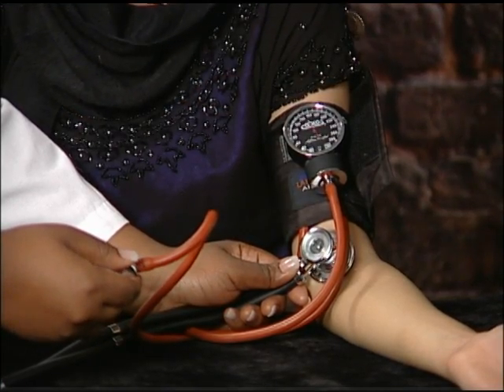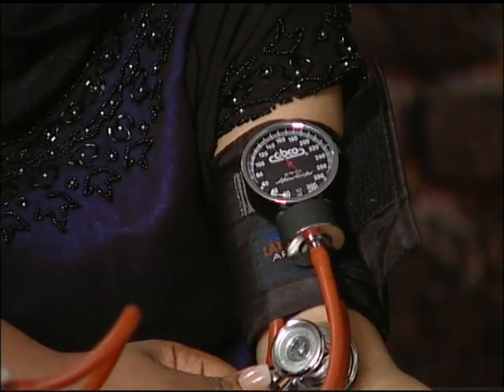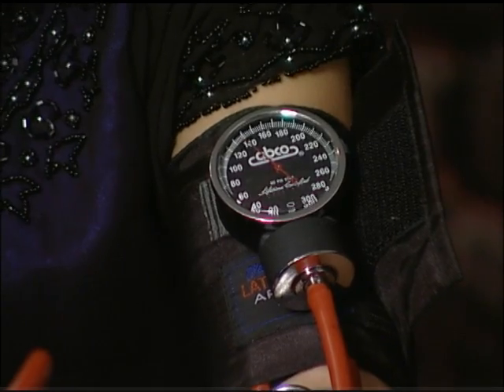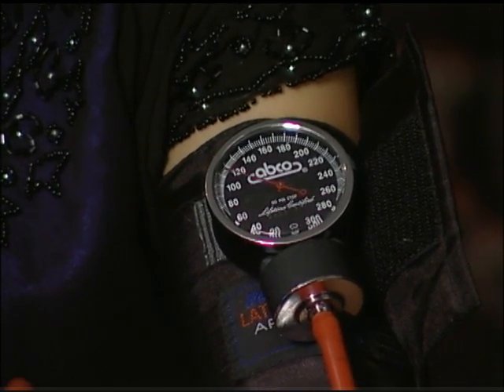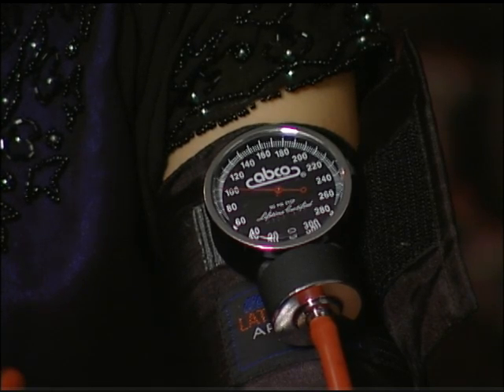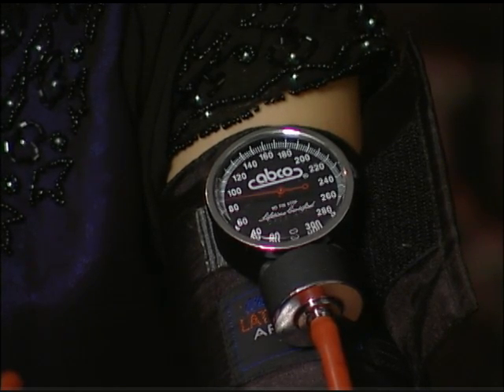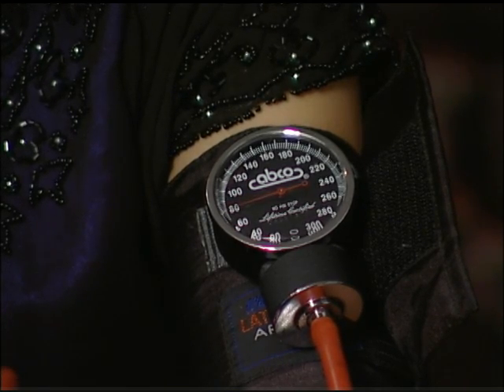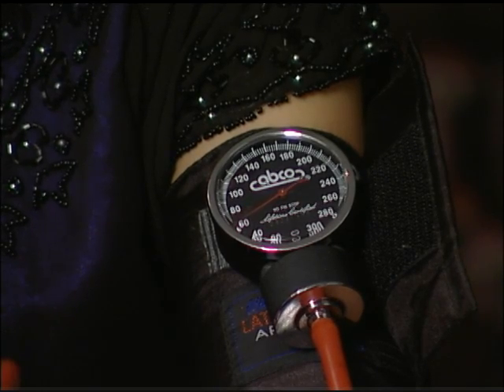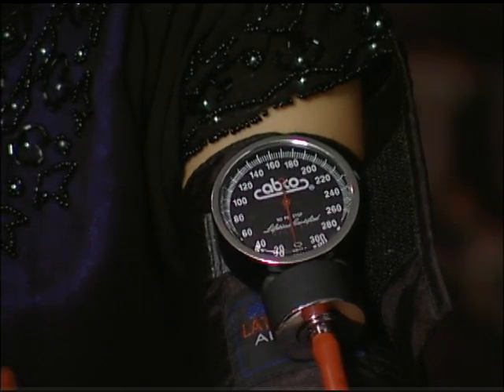Very slowly, deflate the cuff by opening the screw valve to reduce the pressure about 2 millimeters per second. As the pressure drops, you will hear beating sounds as the blood begins to pass through the vessel. Remember the number at which the pulsing sounds start — this is the systolic pressure. Continue to slowly lower the pressure until you can no longer hear the sounds in the stethoscope. The number at which the sounds stop is the diastolic pressure. Remember this number. Then open the screw valve and let the air completely out of the cuff.